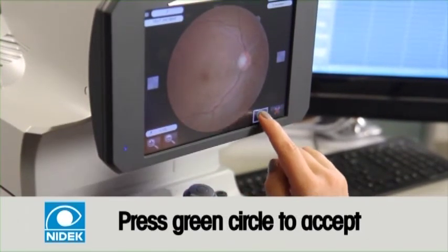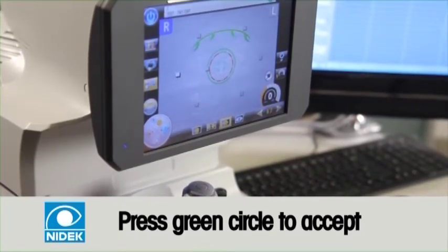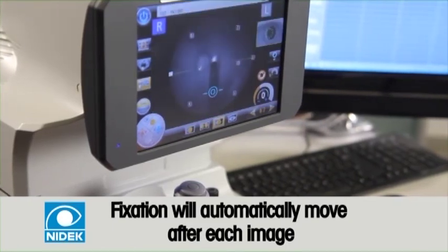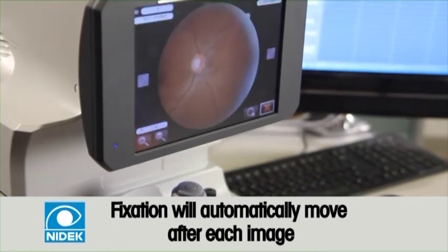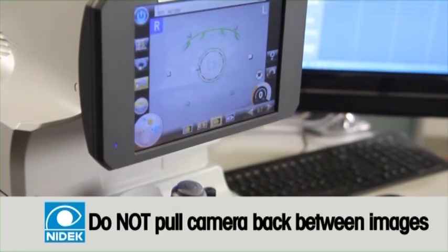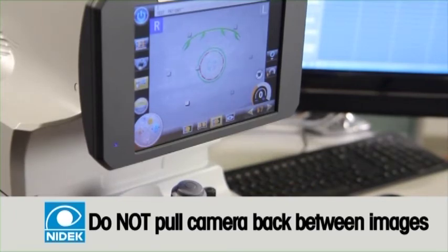While the patient's eyes are closed, press the green circle to accept and save image, or press the red X to delete and retake. If the image is accepted, the camera will automatically move the internal fixation to the number 2 point. If the image is deleted, the camera will remain on number 1 point. Do not pull the camera back in between images. By leaving the camera in the same position, the operator is in perfect position for another image.